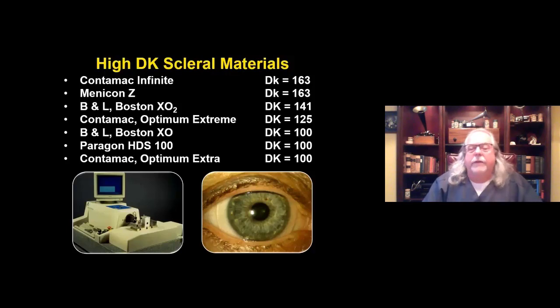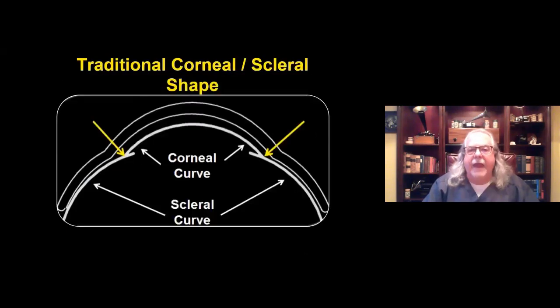So we know that these lenses are incredibly comfortable. We know that they create a semi-closed fluid-filled system beneath themselves, and that we have these high Dk materials, which are a great asset for the long wearing periods these patients have with their lenses.